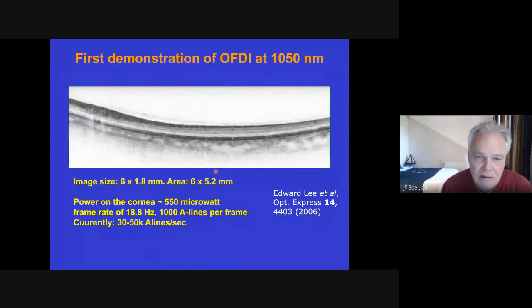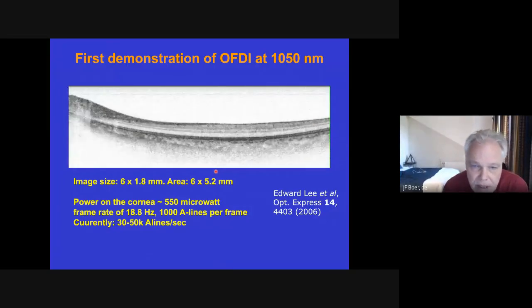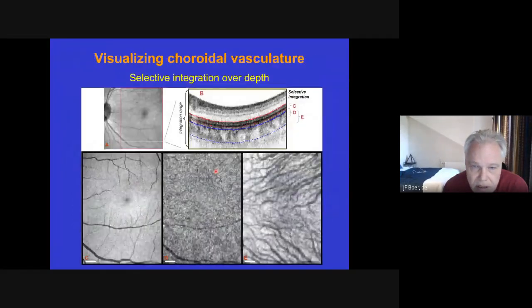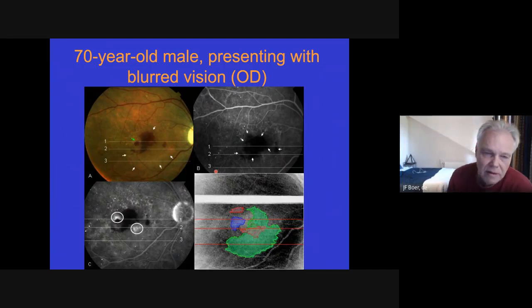I want to end with a little bit more of retinal imaging. This is how, for instance, OCT is being used in the clinic these days. This is a patient that has age-related macular degeneration. It means that there are leaking and bleeding vessels in the retina that create major problems. And so the image that I'm pointing at right now is the standard way of diagnosing AMD. This is just a fundus photo, a color photo of the back of the eye.